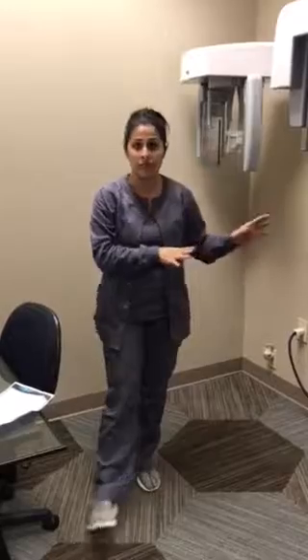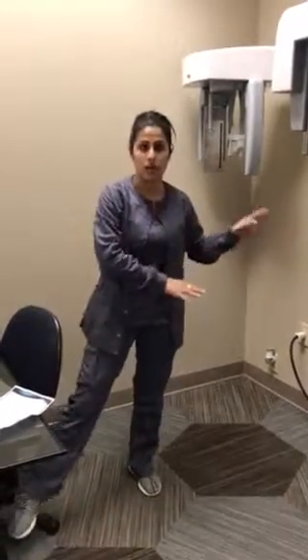289.232, Section I-16, and this is along with the performance evaluation that has to be done by a certified company. So this is in addition to that. You have to do this on your own at your office quarterly, so every 3 months, just like perio maintenance.